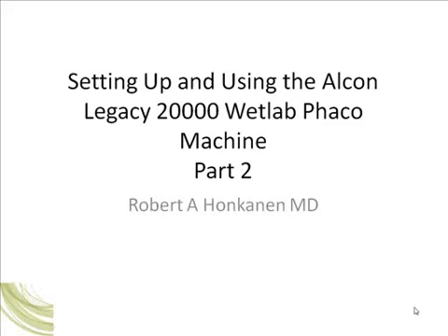Setting up and using the Alcon Legacy 20000 Wet Lab Phaco Machine Part 2. In Part 1 we went over the brief setup of the Alcon Legacy 20000 machine, showing how to connect all the tubing. Now I'd like to go over some basic steps and procedures on how to actually run the machine, change between modes, while at the same time reviewing some brief principles of phaco-dynamics or fluidics that you can kind of visualize or experience when setting up the wet lab.